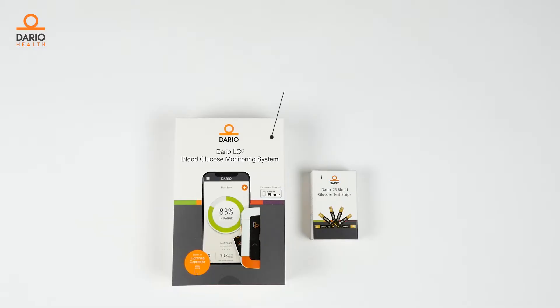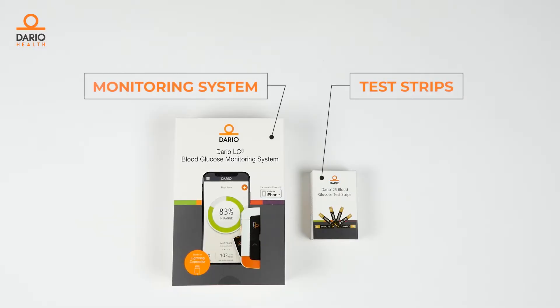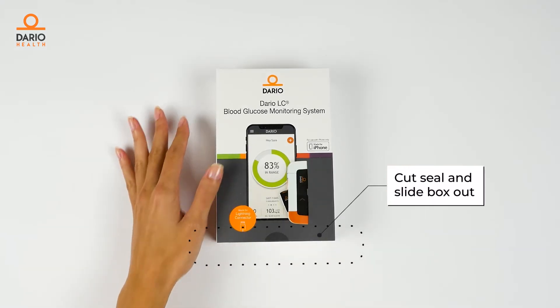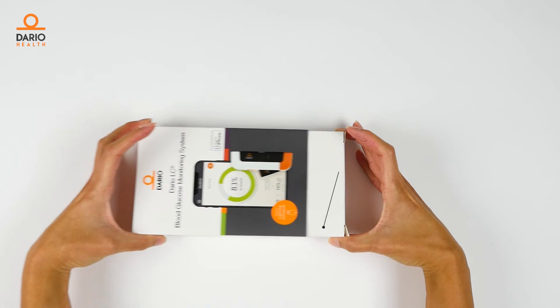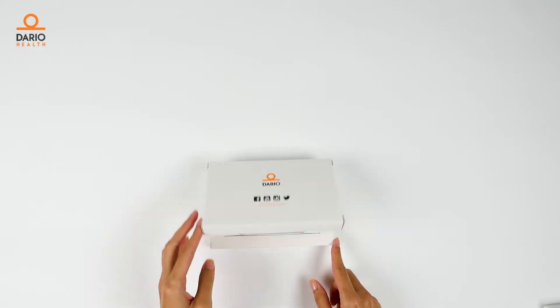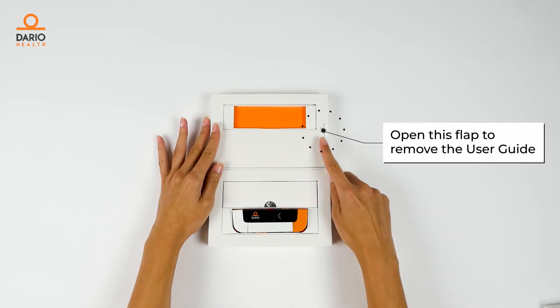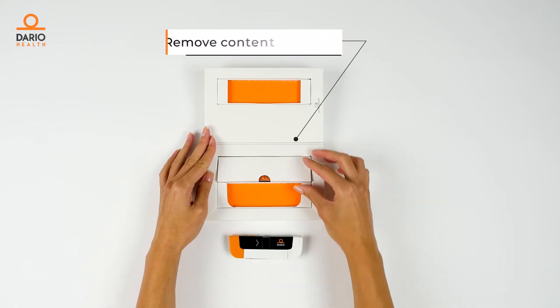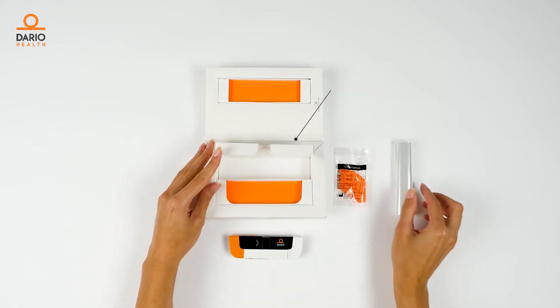Your Dario blood glucose monitoring system contains an all-in-one smart blood glucose meter and a box of Dario test strips. Open the meter package by cutting the outer seal and slide the inner box out. Cut this seal and open. Open the flap on the side of the box to remove the user guide. Remove all the contents from the box.